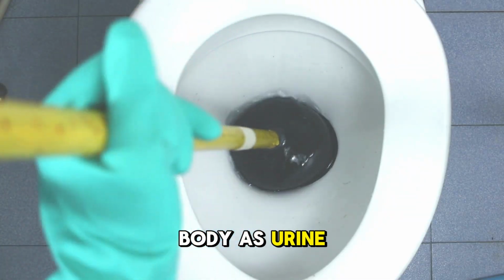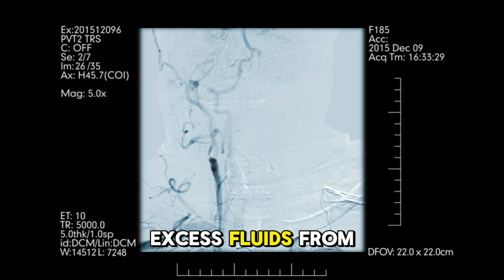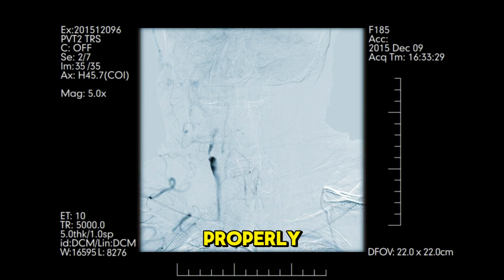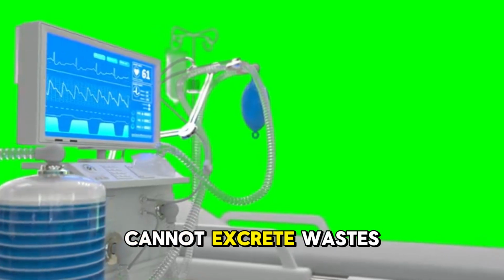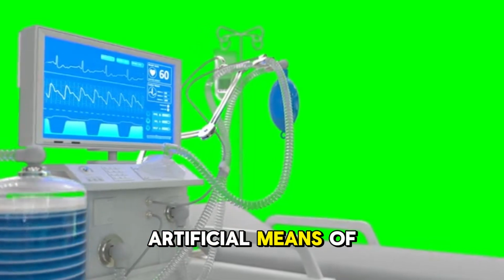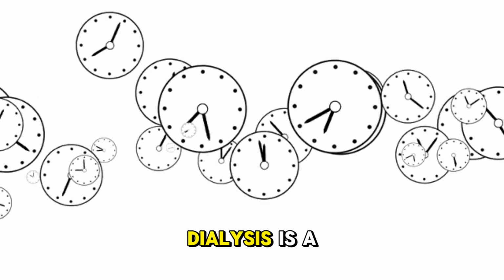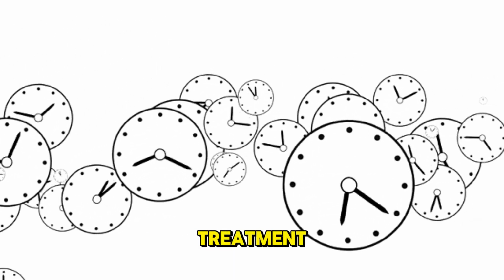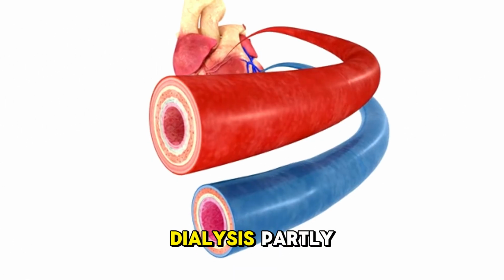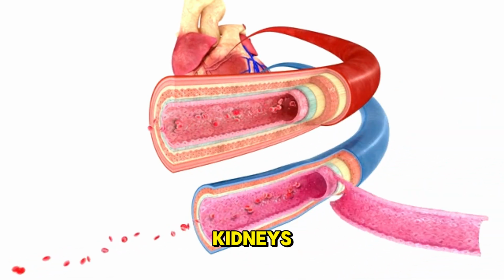as urine. In people whose kidneys have failed, this natural process of filtering wastes and excess fluids from the blood stops working properly. For people who cannot excrete wastes through their urine, dialysis provides an artificial means of performing these life-sustaining functions. Dialysis is a rather lengthy treatment. During a session, dialysis partly replaces the filtering function of millions of nephrons in your kidneys.